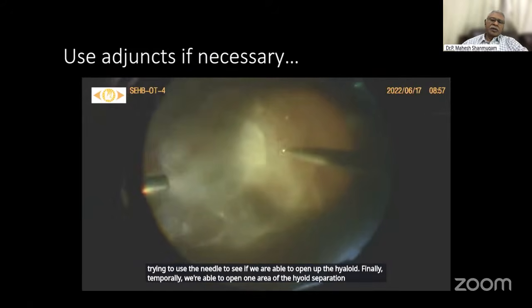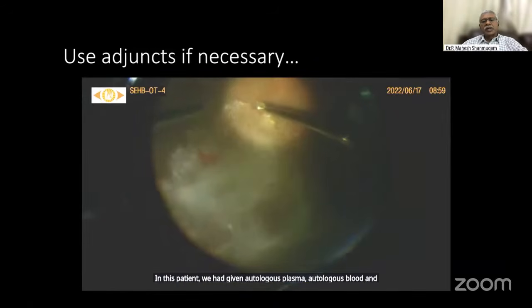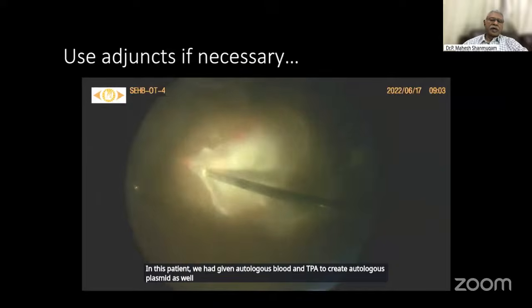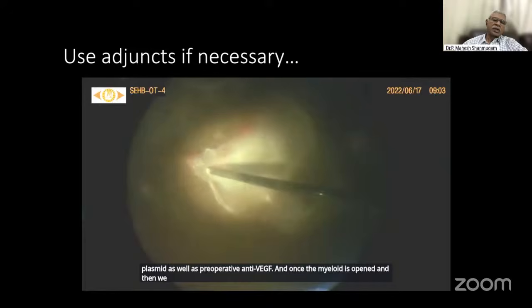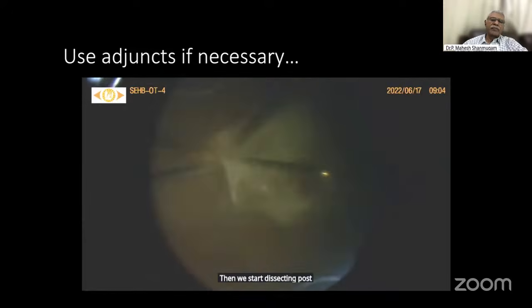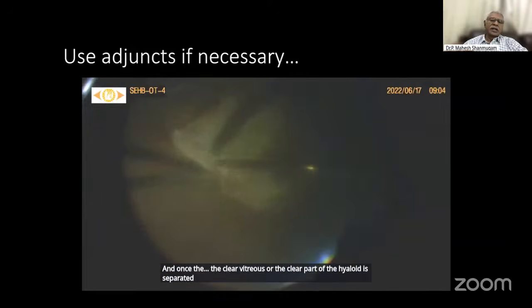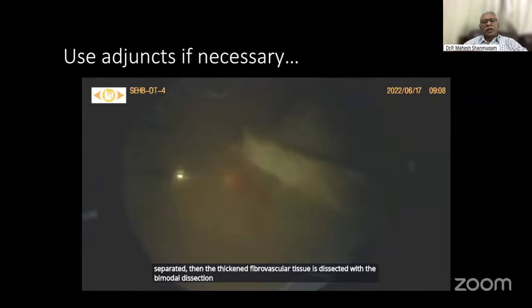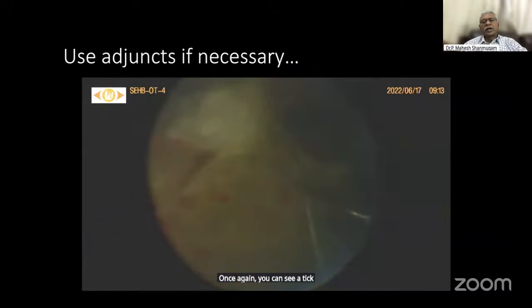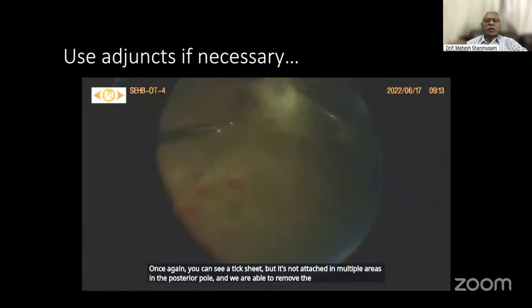In this patient, we had given autologous plasmin, created from autologous blood and TPA, as well as preoperative anti-VEGF. Once the hyaloid is opened and we have truncated the cone, we start dissecting posteriorly. Once the clear part of the hyaloid is separated, the thickened fibrovascular tissue is dissected with bimanual dissection. Once again, you can see a thick sheet, but it is not attached in multiple areas in the posterior pole, and we are able to remove the hyaloid quite well.